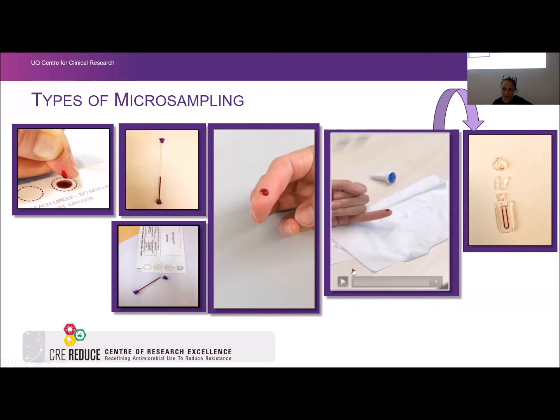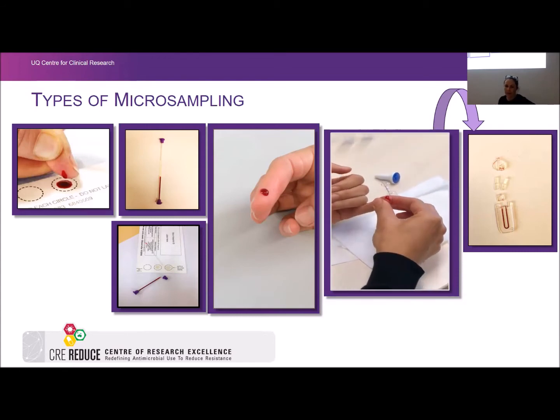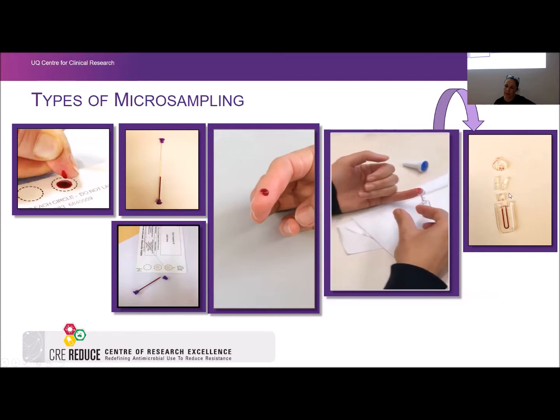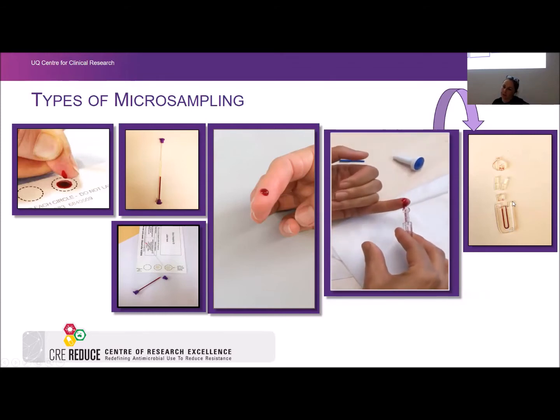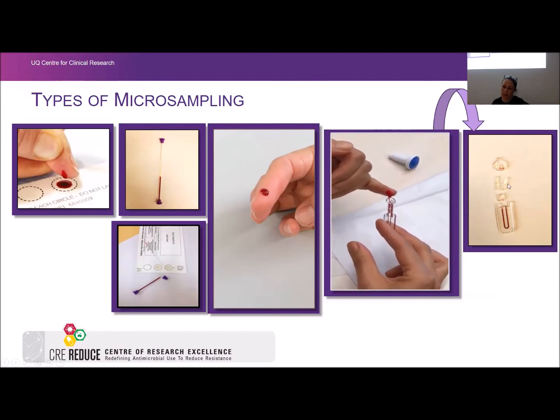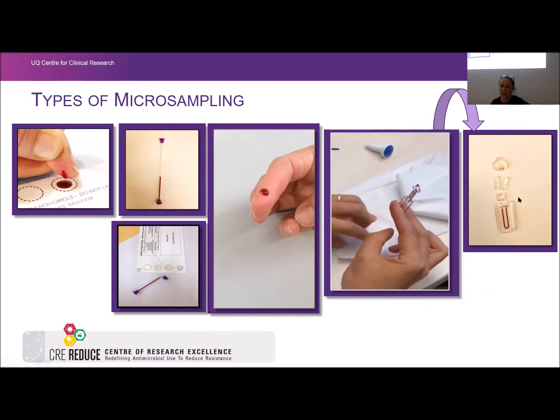I've got another video for you, and this is where I'm collecting a sample. There's a lot of self-sampling going on here, where I'm collecting a sample into a microsampling wing, and this is a microfluidic device, and as you can see, we just collect blood from a finger or heel prick. It moves through a fine microchannel, which you can see in this end picture here. It's centrifuged, and then the top part of the microfluidic device can be broken into parts. You can collect a duplicate analysis here of 2.8 microlitres of plasma, and then they have what they call the lucky zone, which is here. And if that's filled with plasma, you'd be able to obtain a third sample at 2.5 microlitres.